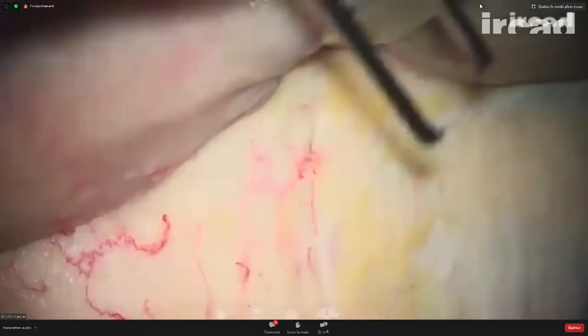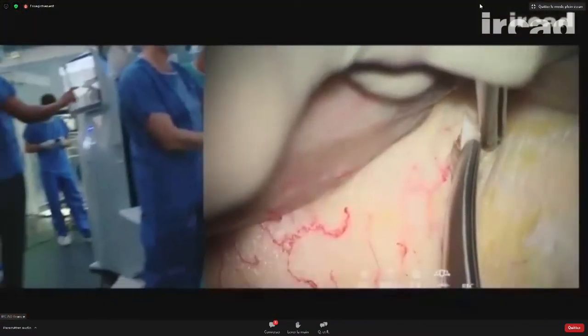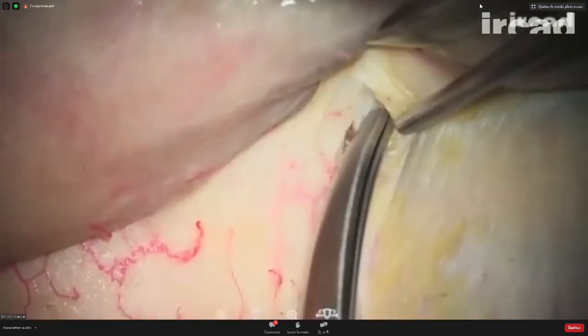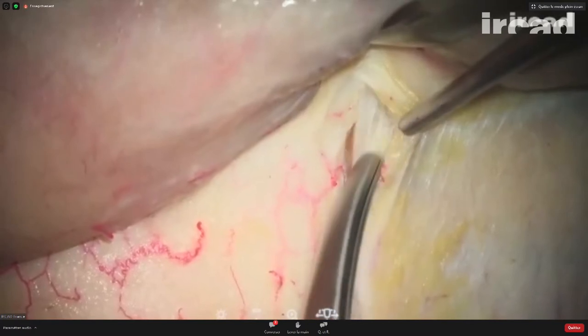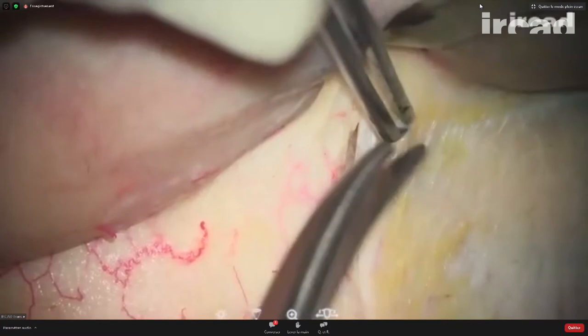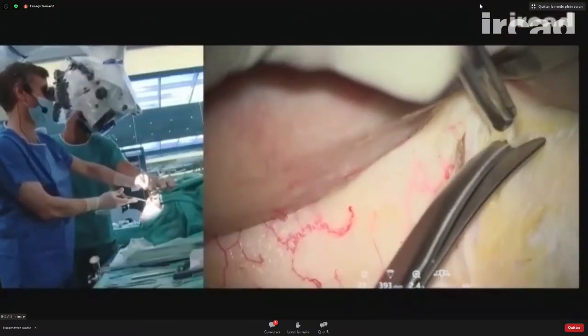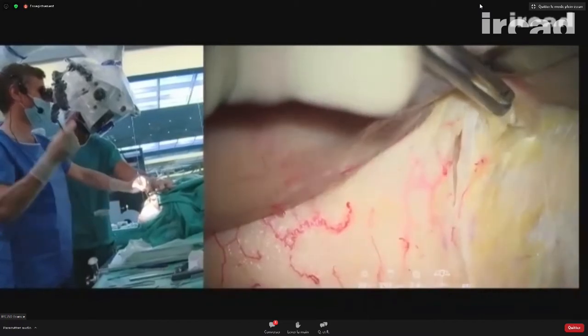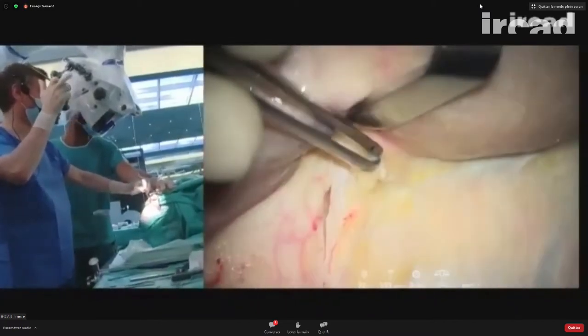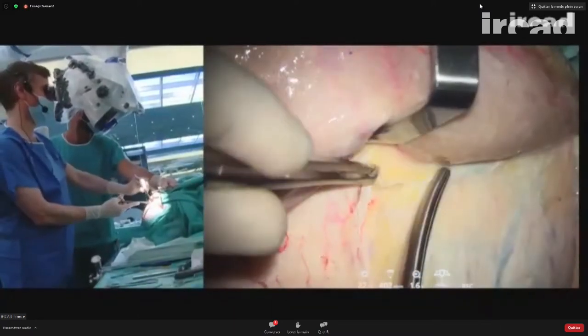So if I hold the superficial fascia here, I can see both fascia: muscle fibers, deep fascia, superficial one. And I can cut the superficial layer here. And this is my interfascial dissection.